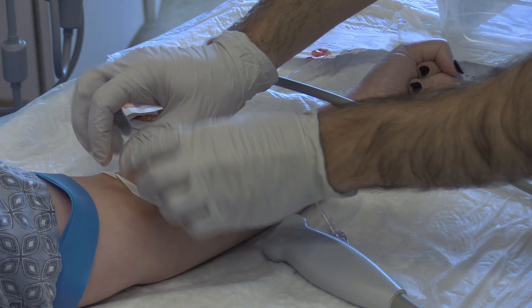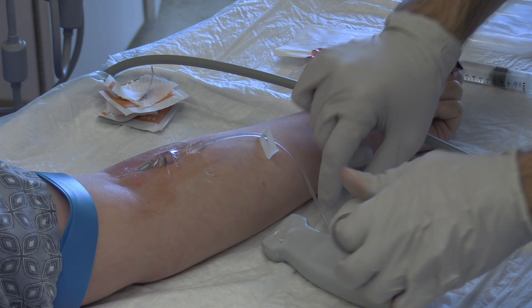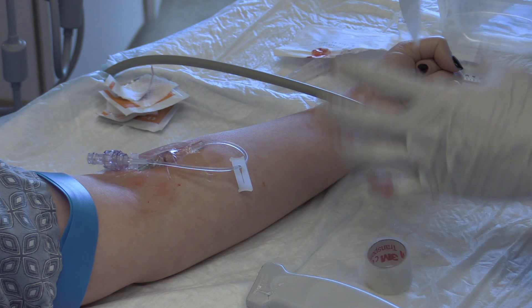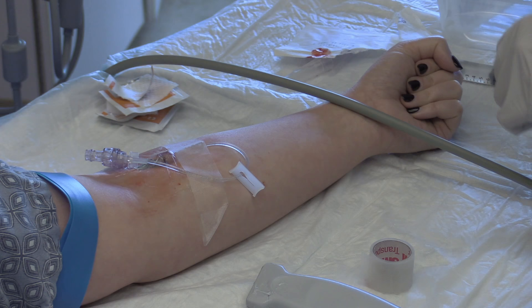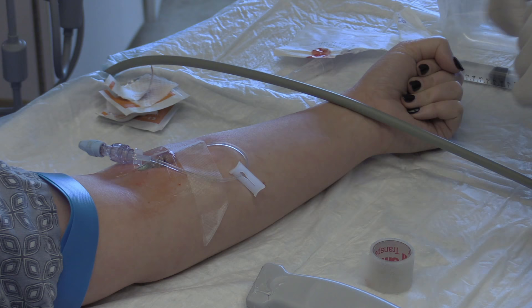Clean any blood or ultrasound gel from the skin. Apply a double Tegaderm over the catheter base. Loop the extension tubing to keep things neat, and apply a single piece of tape over the setup to stabilize. Finish the procedure by labeling the IV appropriately and applying a protective cap over the exposed port if applicable. Remember to safely dispose of your sharps.